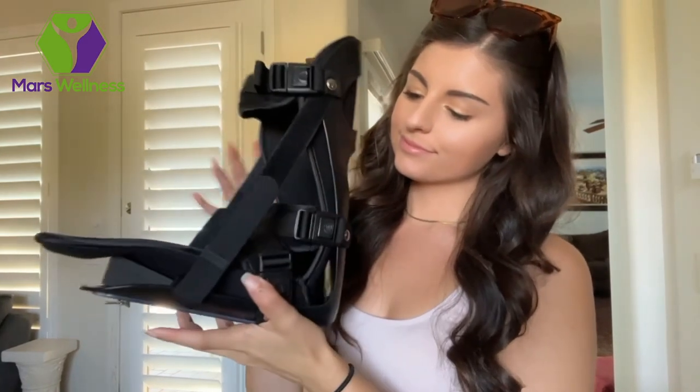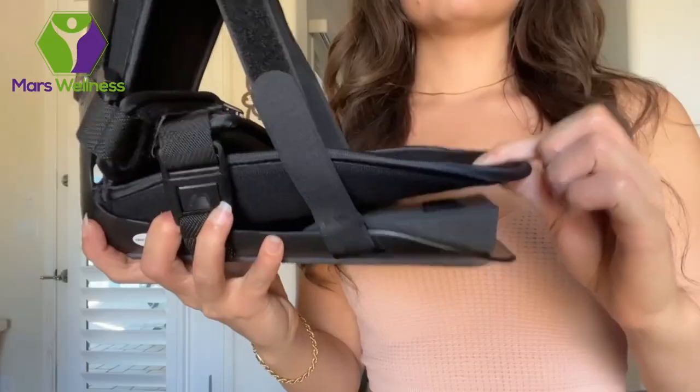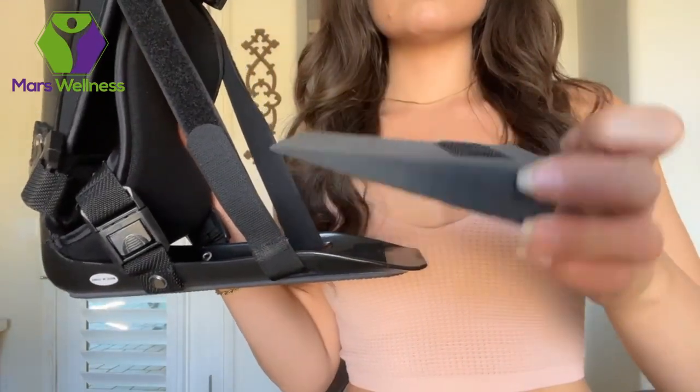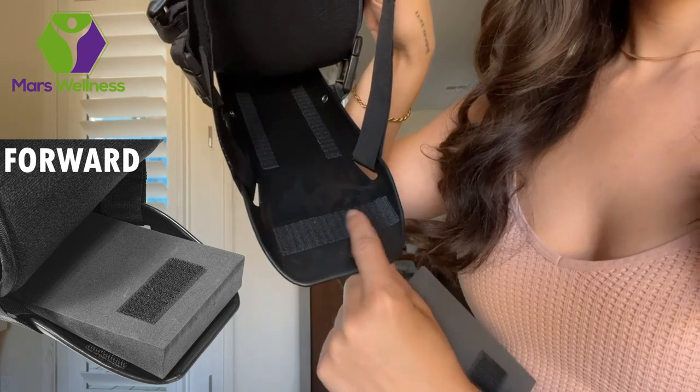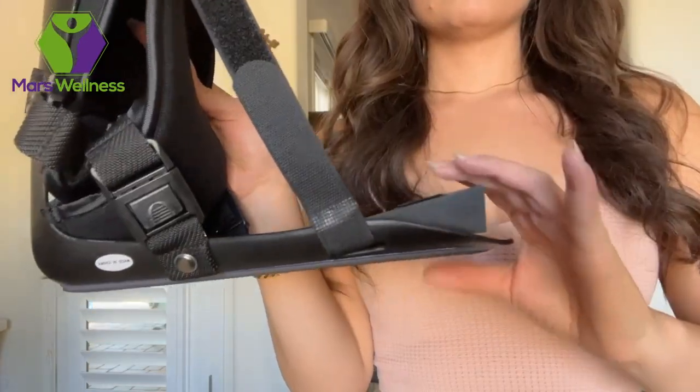This is the plantar fasciitis posterior night splint by Mars Wellness. It has a foam wedge included to adjust the size of your stretch — it is velcroed on both sides. Moving the wedge forward is less stretch, and moving the wedge back is more of a stretch. Choose your option and put the padding down.